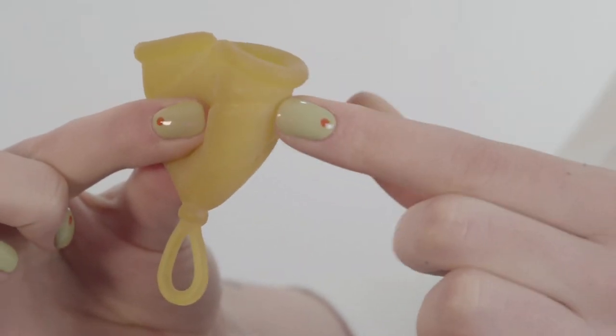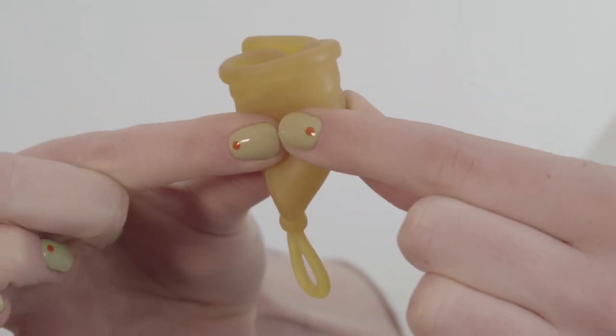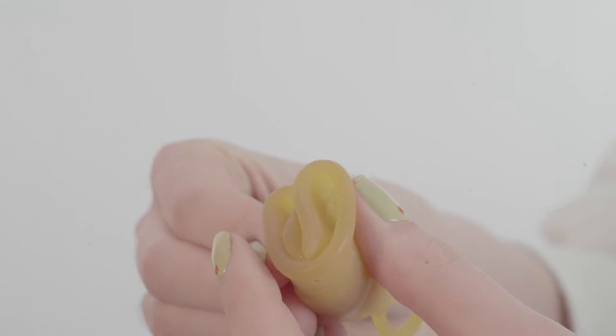Or you can use the U-fold, sometimes called the C-fold, where you just fold the cup in half lengthways. It's the first fold I used when I started using a menstrual cup, and you can do it with one hand, so it's really easy.